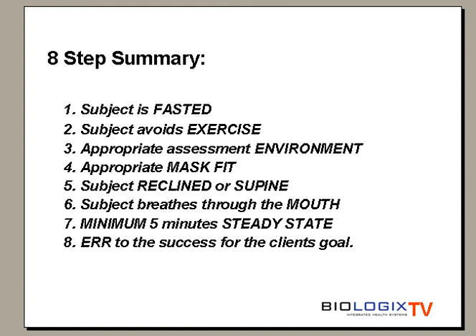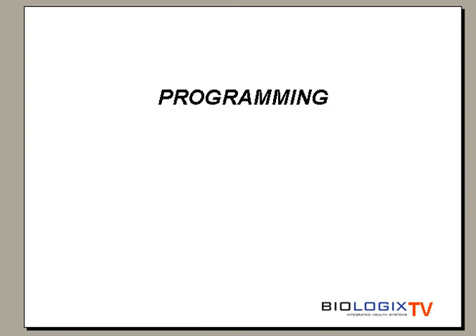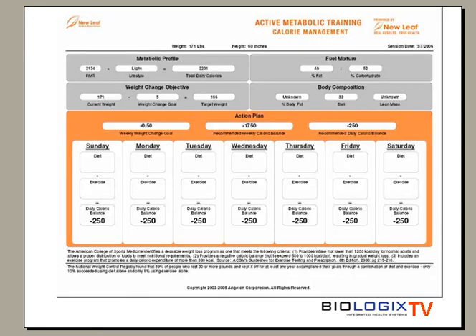So you have that number, so now what? Well, it's time for a brief look at nutritional programming from resting metabolic rate assessment. Firstly, your form will look something like this if you're using our ExoSmart 6.2 software. The form gives you the opportunity to input, along with the client, a structured caloric plan. In this example, the client is simply looking to create an energy imbalance or deficit of 250 kilocalories.